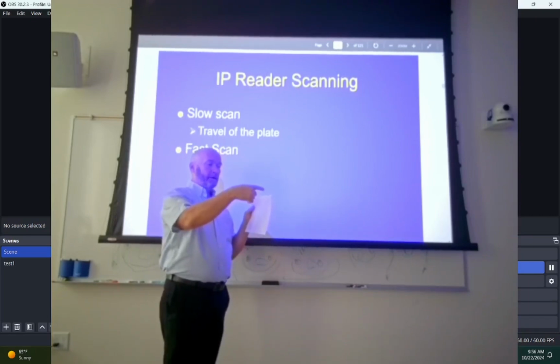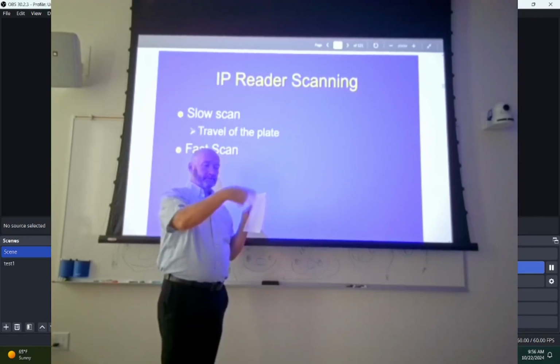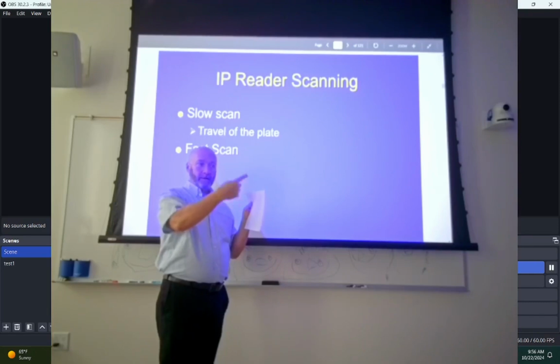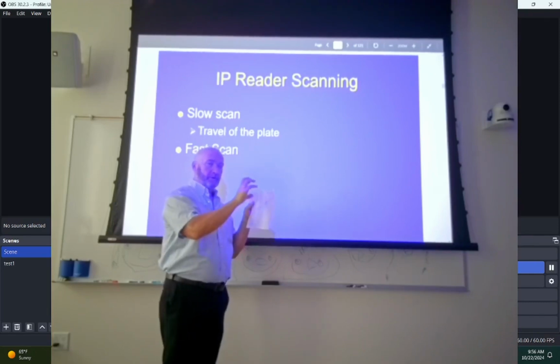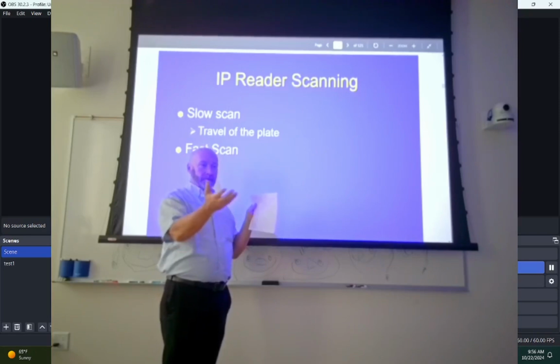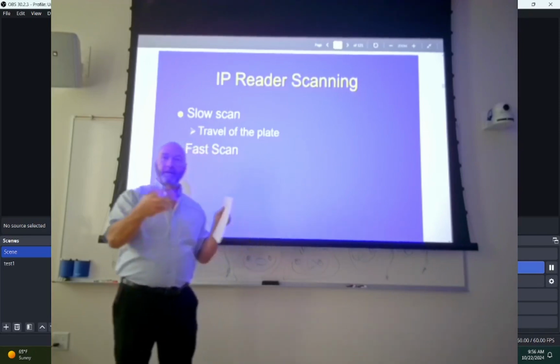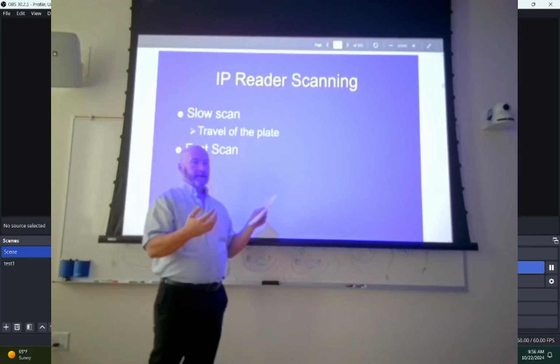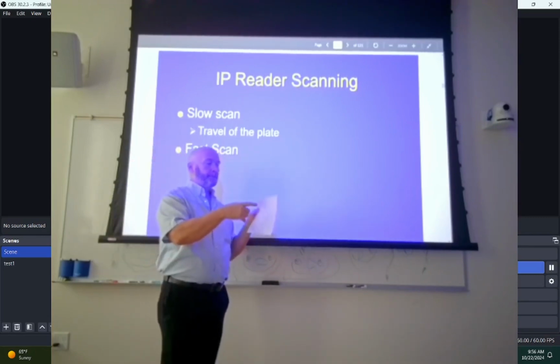What if our laser, maybe it's not stable and it's shaken this way while it's pivoting this way? What's going to happen to the phosphors away from the place it's trying to focus? They're releasing energy. They're going to be lit up too. They're going to lose some of their energy. And again, we've got bleeding and blending of light. It's going to be a fuzzy image, right?